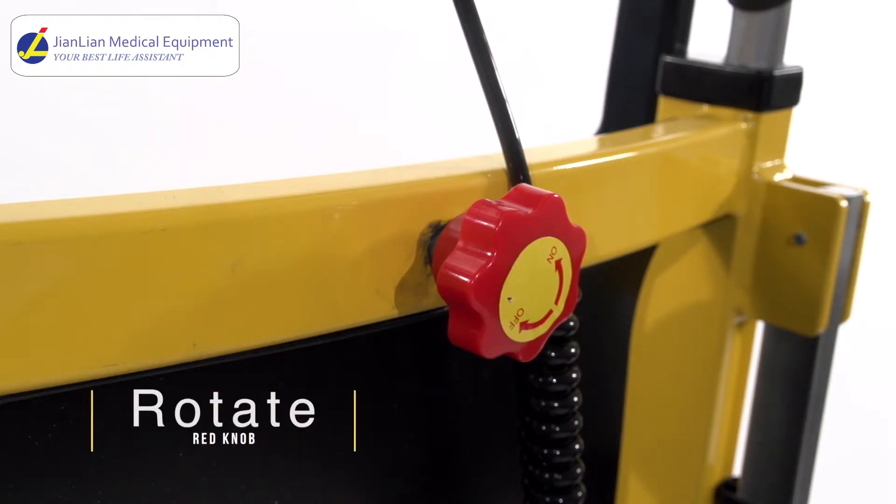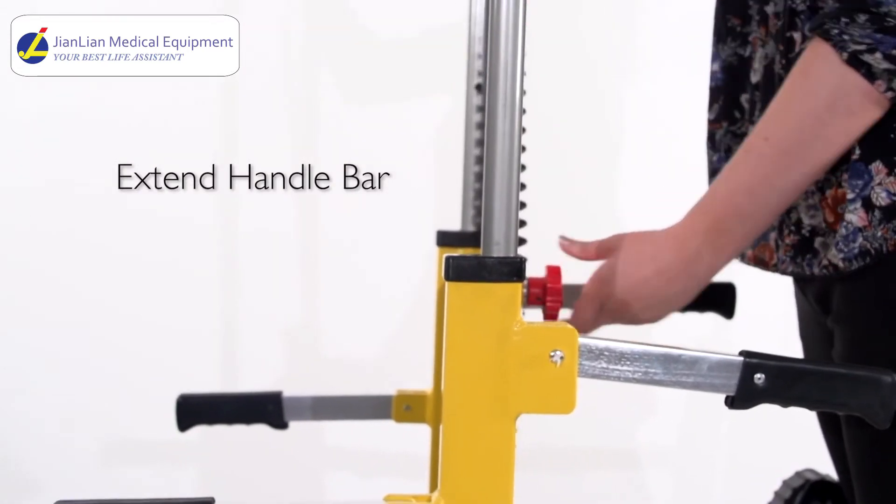Rotate the red knob behind the chair to adjust the telescopic handrail. We recommend that you extend the handlebar to its highest level. To get familiar with using the chair, practice going up and down the stairs without a live body. This ensures the safety of the patient and yourself.